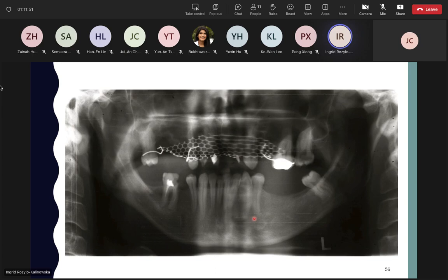I told you about removable things. Some things are removable, but they are not removed for radiography. And it's mainly because of two reasons. It's not the fault of my radiographers because they remember. It's the fault of a patient. So sometimes patients do not hear the instructions or they do not understand the instructions. So this is one group of patients.